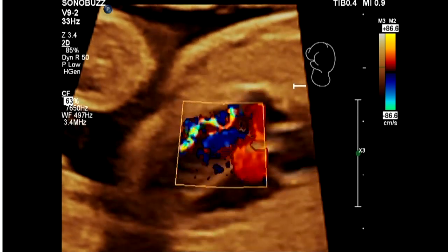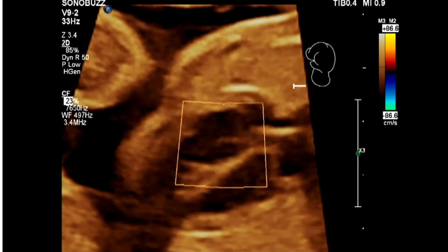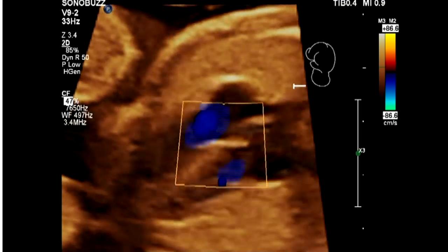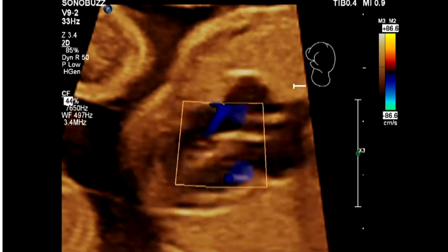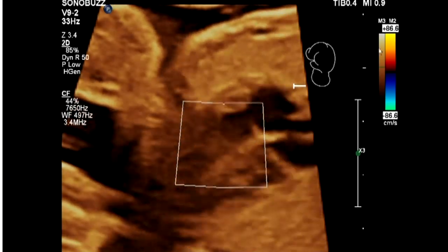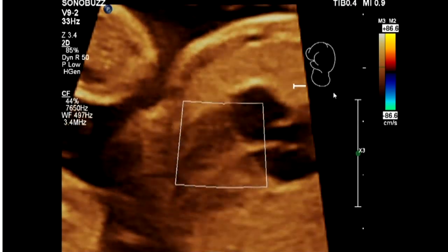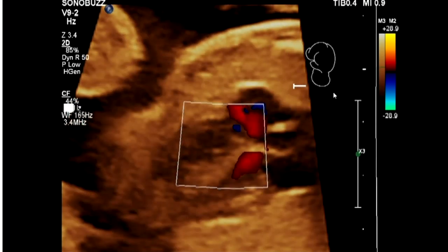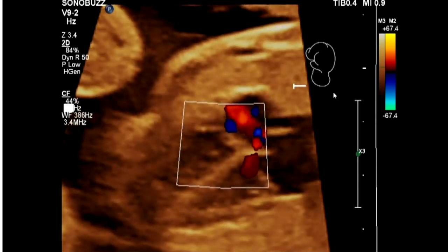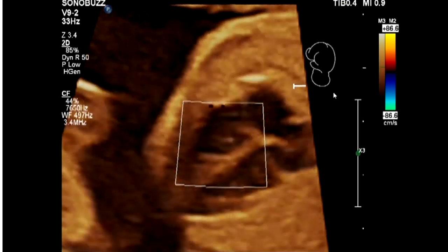You can see the inflow and no regurgitation during systole. If I had increased the gain too much it looks like this; if I lower the gain too much you don't see much. You have to put just the right amount of gain — the right amount at one point in the exam may differ the next minute. The scale up here you usually want very high so you don't get artifactual TR. It's a combination of working with the color gain and the scale to make sure you have enough sensitivity but you're not bleeding into the septum.